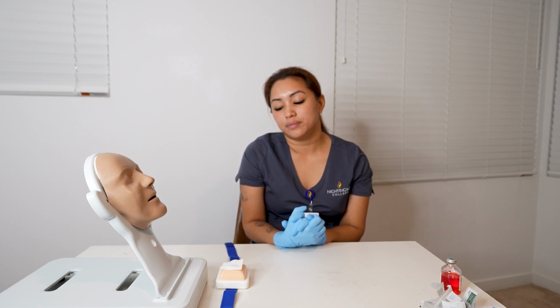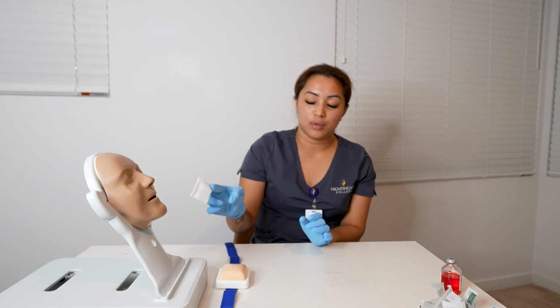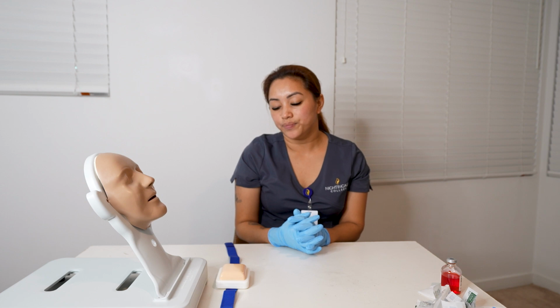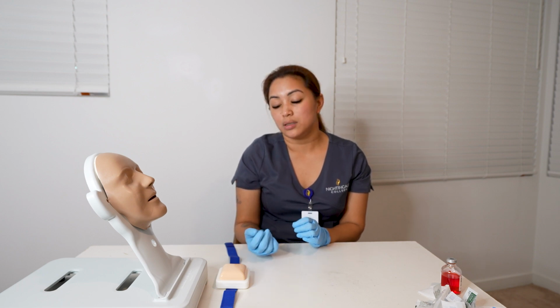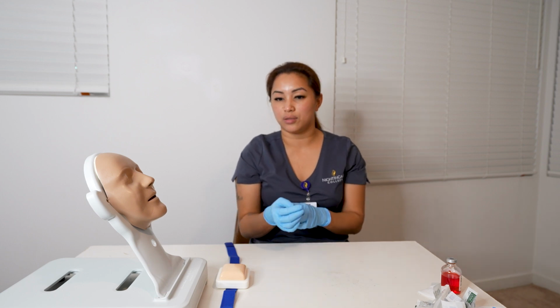And all right, so it has absorbed, so we can throw this away. And then now I am going to, sometimes they need a bandage, but in this instance we don't need a bandage, and that would be it. All right, everything's right, everything's in the right container.